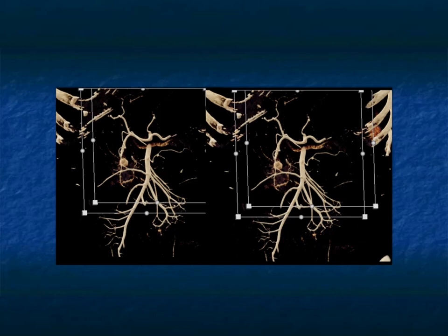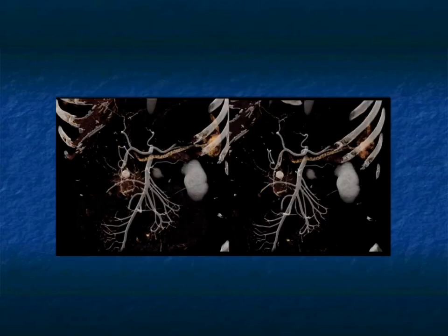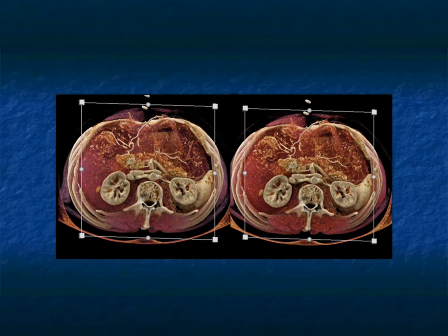We've done work with AI for detecting neuroendocrine tumors, and the accuracy of AI is in the high 90%, 20% better than radiologists, particularly for smaller tumors. And again, here's just some more images showing that. You can see certain things to also understand that cinematic rendering would be ideal for detecting these tumors, but also for staging, preoperative planning. We've also published a recent article that shows when you have neuroendocrine tumors or potential neuroendocrine tumors by tail of pancreas, and your question is this a neuroendocrine tumor or a splenule, looking at the texture maps can help you make that decision. So very important. And again, changing the parameters allow us to see things differently.